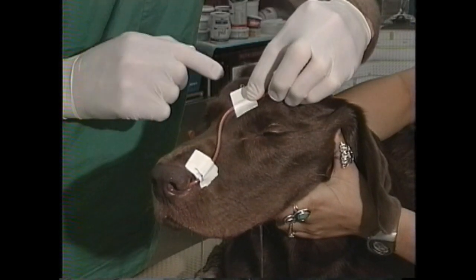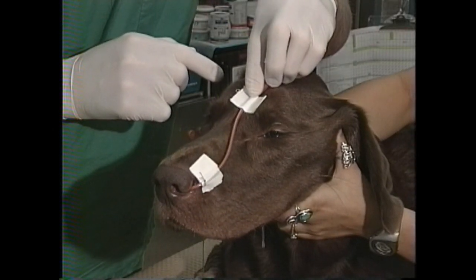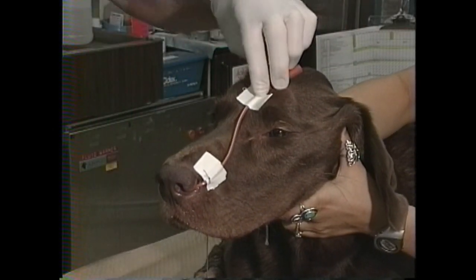I'm going to create an exaggerated S-curve, positioning the tape a little bit towards the right of the midline on the dog, so that after I've got this anchored to the skin and release it, the tension from the catheter will pull it back straight so the catheter runs right down the middle of the dog's head. I'll create this over-corrected S-curve and suture in that location so hopefully it'll end up centered.